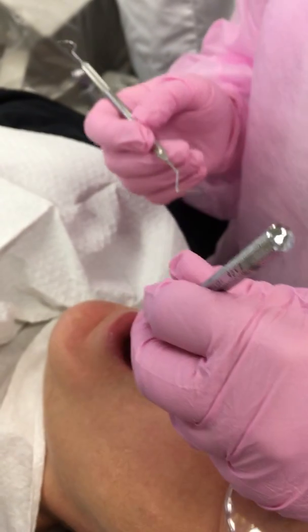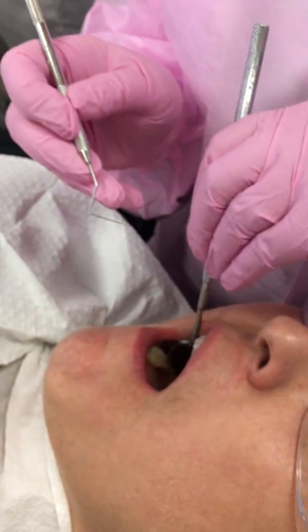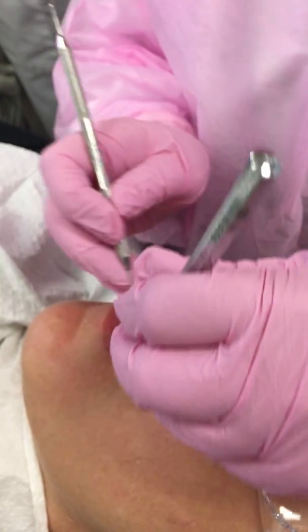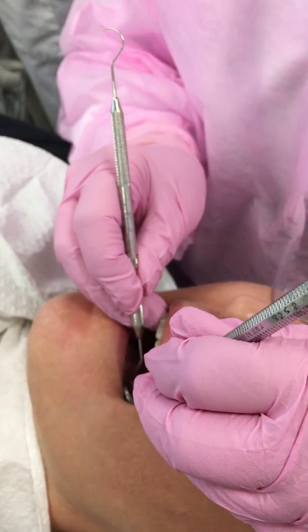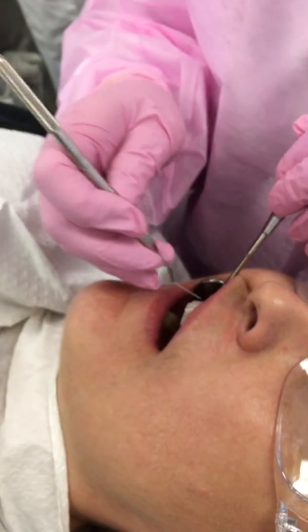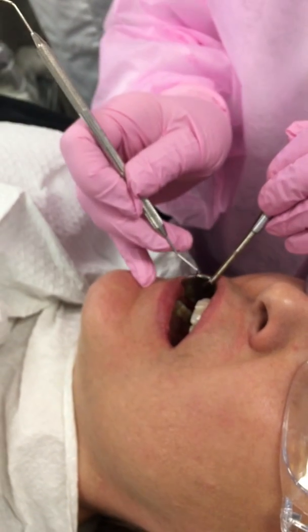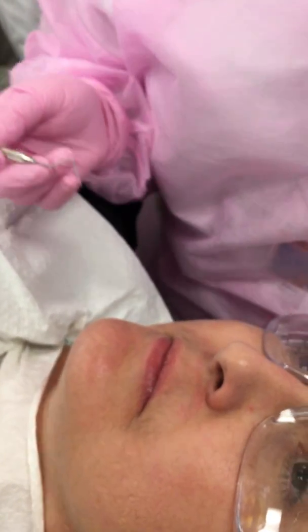What I do, I start on the lingual on the right, and I work across to the lingual of the left, and then I come back and I do here, and then I drop down and I do the linguals of the lower, and then I finish up on the buccal. That's me. There's no wrong way. You just have to make sure whatever way you do it, you do it the same way every time.